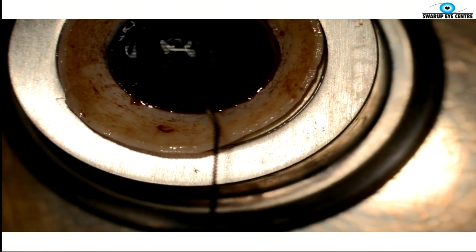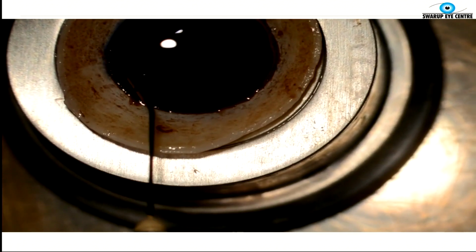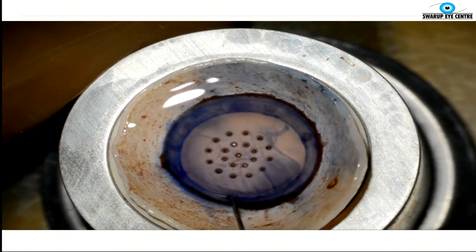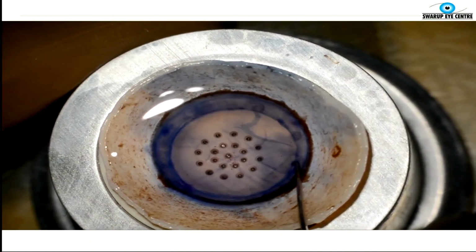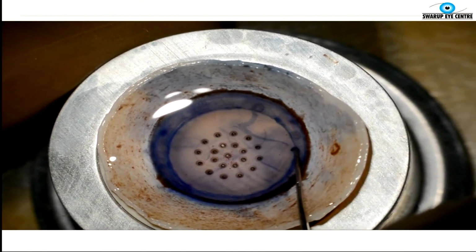It's a good idea to also stain this edge so that you can actually see the cut edge of the Descemet's membrane, and it helps you visualize the Descemet's membrane better. Now you can see the edge, and you can go all around and just lift that edge of the Descemet's membrane with any blunt instrument. In this case, I'm using a Sinskey hook. You have specialized Descemet's elevators that are available also if you want to spend money on those.